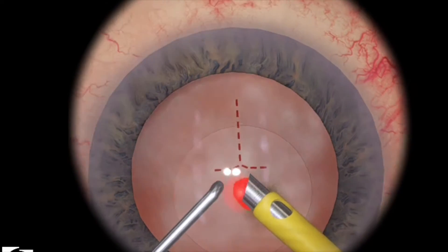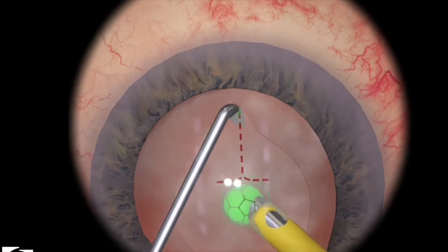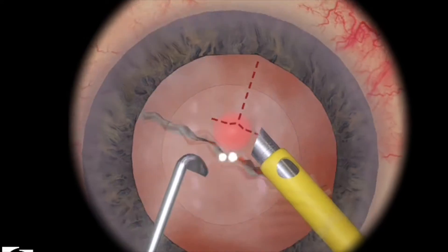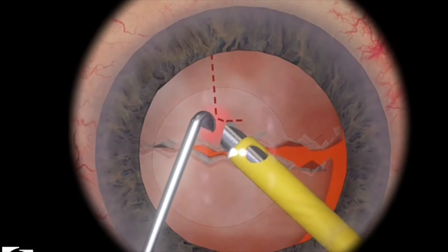This is very similar to the chopping level that you did in Cataract B. You want to have a higher vacuum setting, and then also you want to set it to quadrant removal 1 in your OR machine.